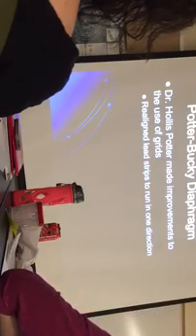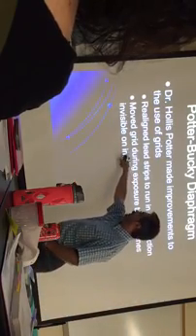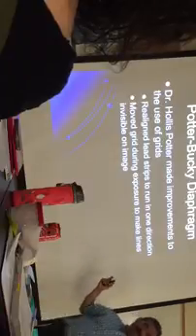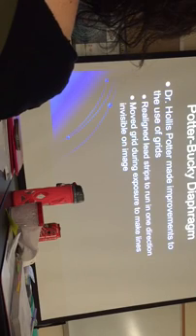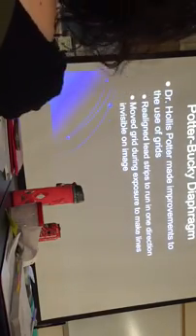So he realigned lead strips to run in one direction. And then the other thing that he did is move the grid during the exposure. Lines were invisible. That was pretty cool. Remember we had talked about grid lines? Potter designed a mechanism that moves the Bucky while you're making the exposure. Remember I showed it to you with that machine last year? I did. If you forgot, I did. And so the Bucky moves when you make an exposure.